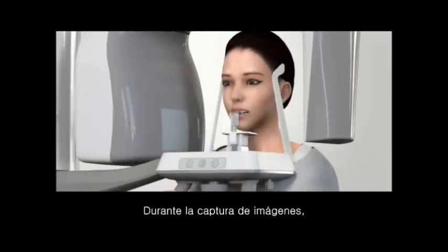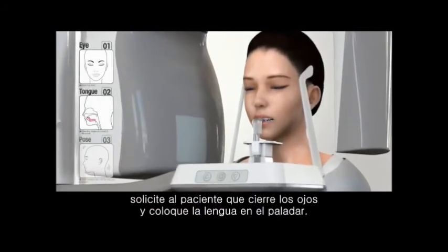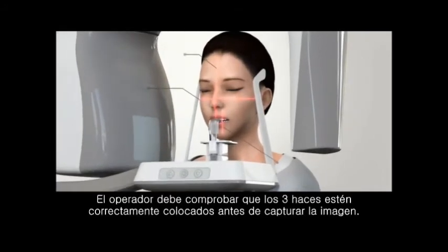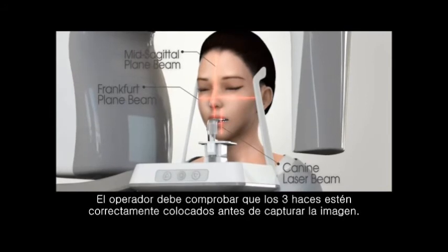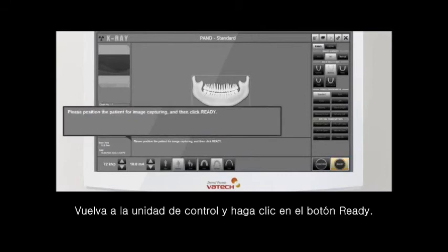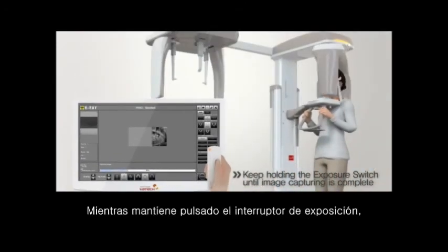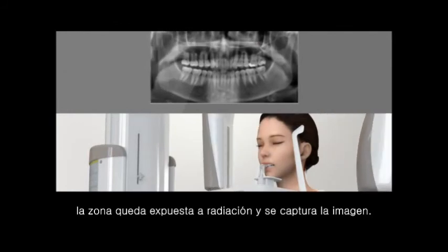During image capturing, ask the patient to close the eyes and place the tongue on the hard palate. Also, instruct the patient not to move until the image capturing is completed. Operator should confirm 3 beams are placed appropriately before capturing the image. Go back to the control unit and click the Ready button. Press and hold the exposure switch as the guide in capture software. While the exposure switch is held, radiation is exposed and proceeds taking the images.